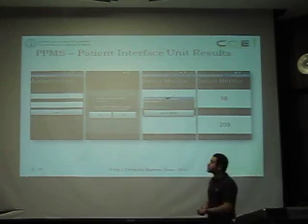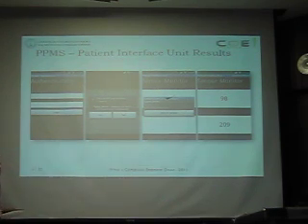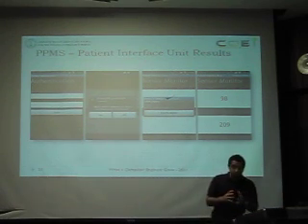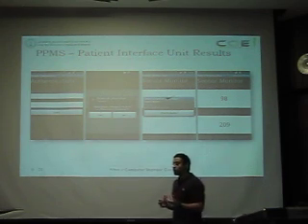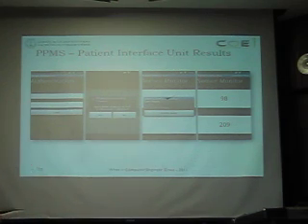These snapshots represent the app that we have developed for the patient interface unit. We have added a level of security to ensure that each person that is involved with the patient verifies himself before entering any notes for the corresponding patient.